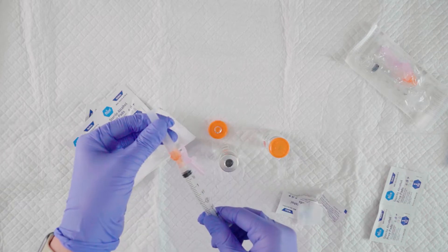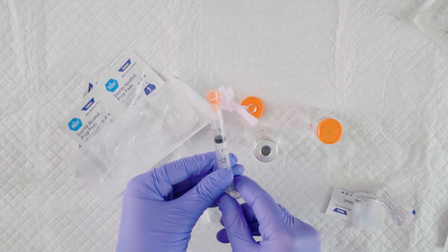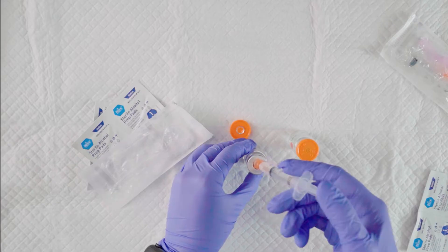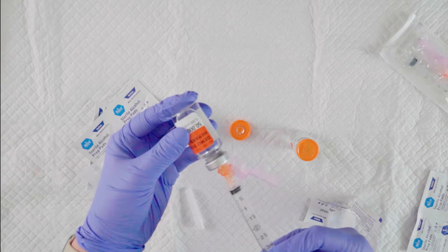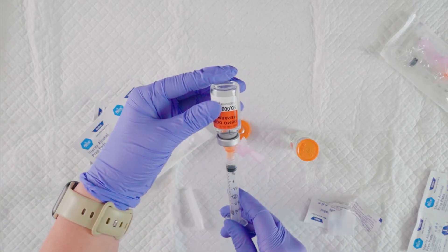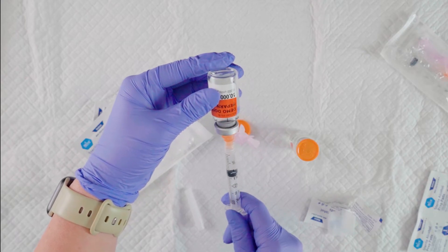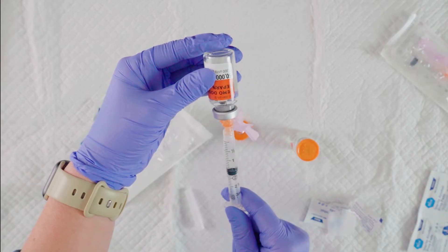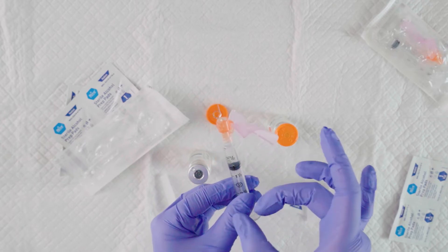Then we'll uncap our needle. We're going to pull back air volume equal to the same amount the order is for. Put the needle into the vial through the rubber top, then inject the air into the vial by pushing the plunger in. Keep the needle in the vial and turn it upside down. With the tip of the needle in the liquid, pull back on the plunger to draw up the ordered volume in units. Check for air bubbles and gently tap the syringe to remove any if present.